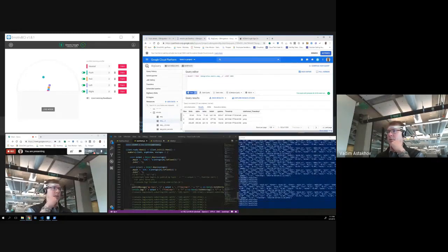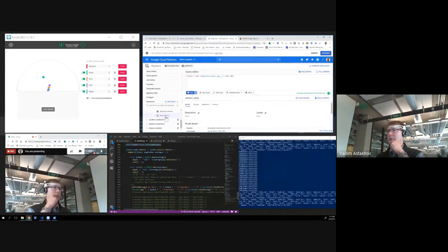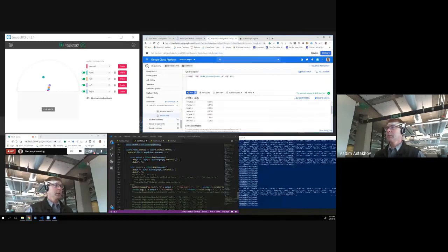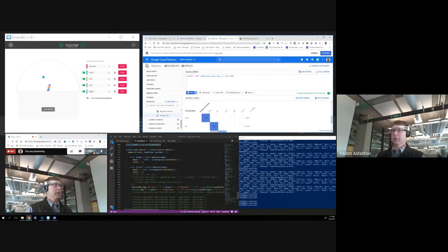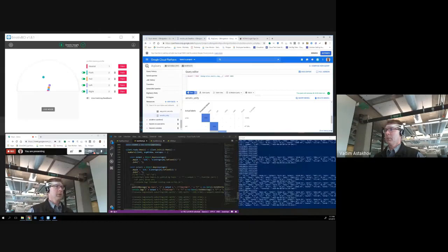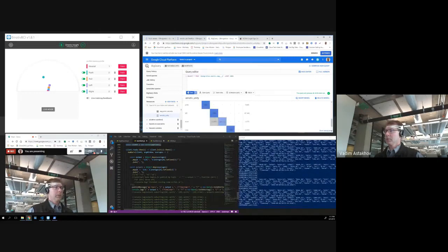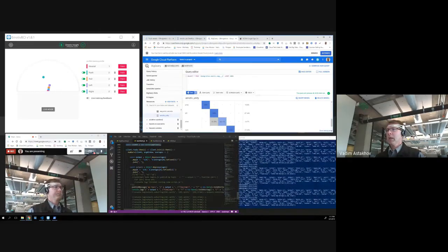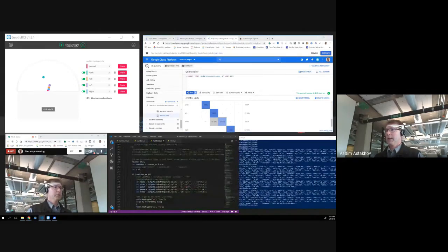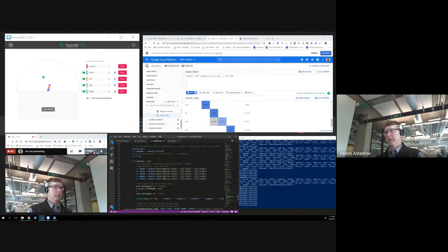And those annotated data are used to build the model. I use a BQML model to train the algorithm and be able to recognize when I'm thinking about a certain activity. For example, when I'm thinking about pushing mouse left, pushing mouse right, jump, or some other things, also shooting. So it's basically a mental command that I use to control the gaming environment. And then I have another source, another Node.js code, that actually controls the gaming environment that I will show in the next demo.